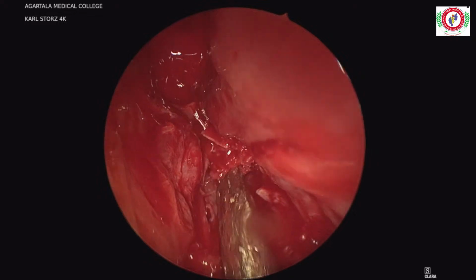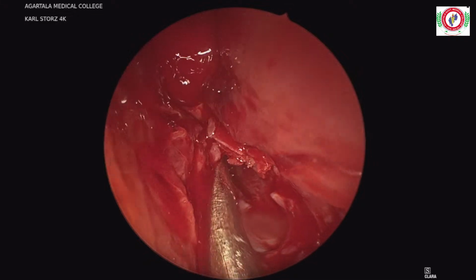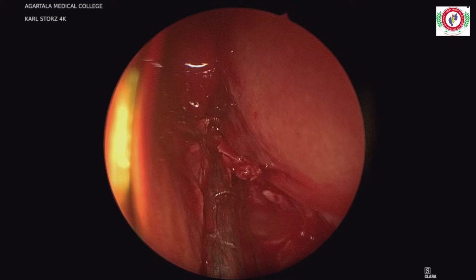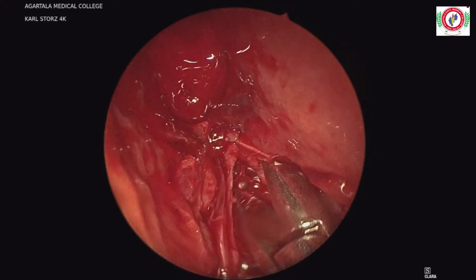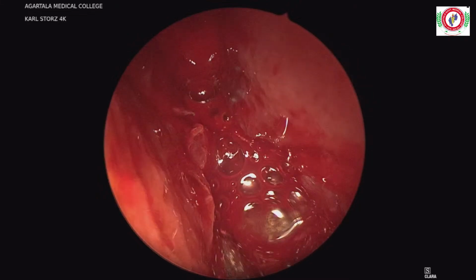Yes, tap tap, tap tap. Harder, son. Yes, done. That's it, it's done. Suction. Yes, you see this spur? It's now free. Okay.